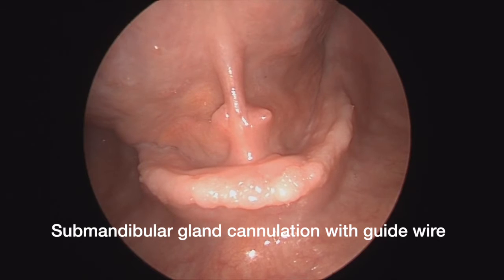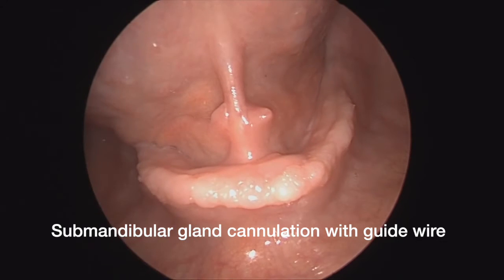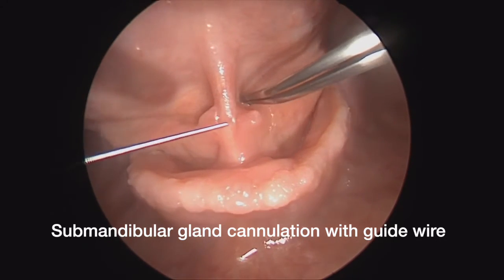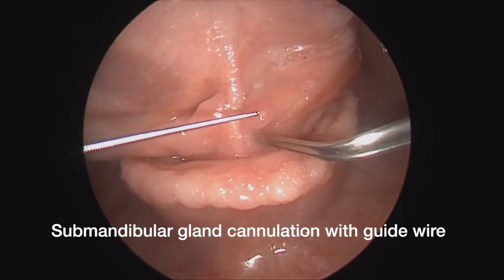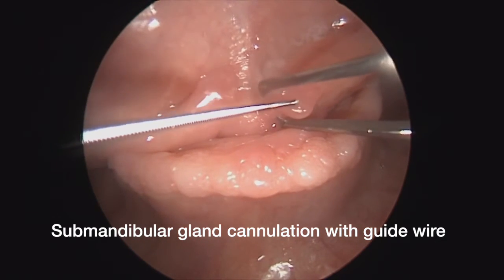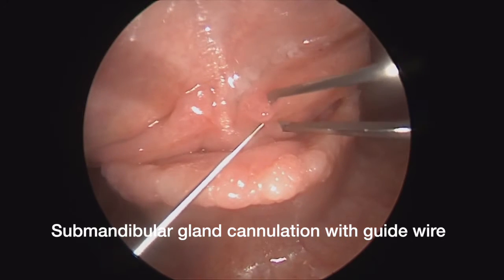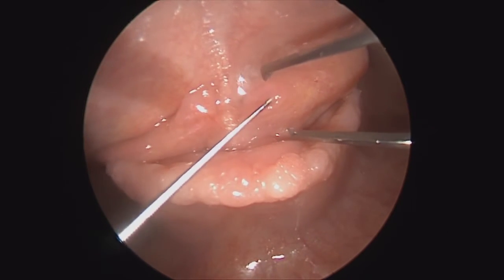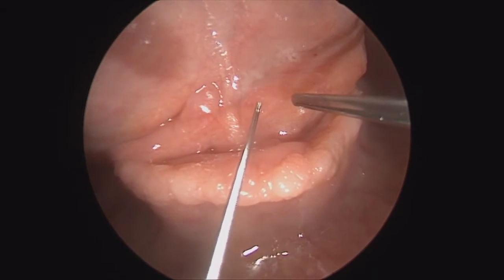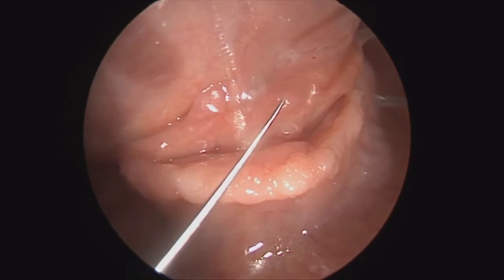Next, we'll discuss the use of the guide wire and Seldinger technique for cannulation and dilation of the submandibular duct. The submandibular duct opening is more variable than the parotid duct, but in general, this opens into a narrow opening at the summit of the small papilla termed the sublingual caruncle at the side of the frenulum of the tongue. This can be in any orientation at the tip of this caruncle, and it's important to note that the most anterior duct is going to be the submandibular duct, as several papilla may be present from the sublingual ducts as well. Placing tension on the submandibular papilla is helpful. Here a tooth curved forceps is used, and then the guide wire is used to feel along and engage the opening, and then it is passed gently in order to prevent perforation.